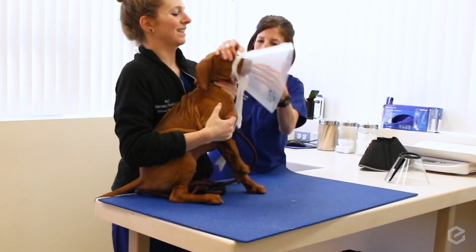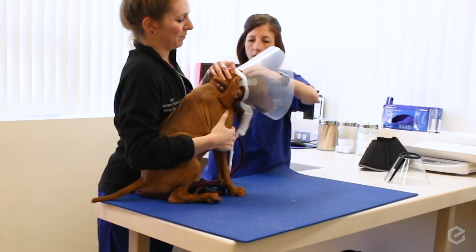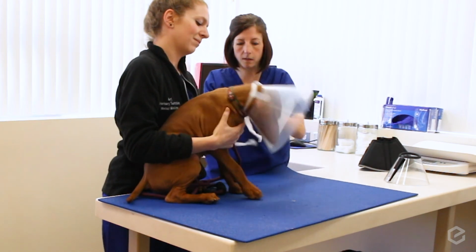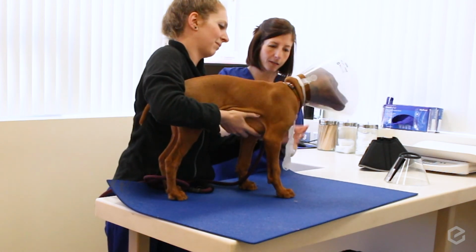And sometimes it can be a challenge. Make sure that their ears are through. And then you would tie this in a bow to make sure it stays on tightly. And now he's got his e-collar on.